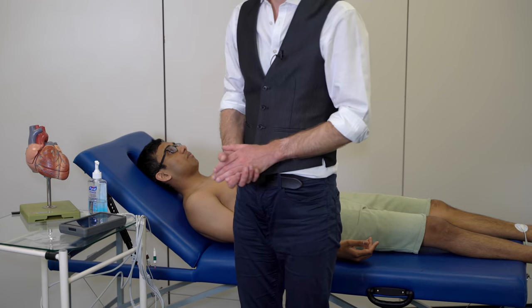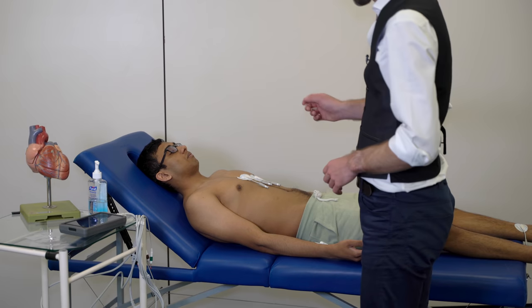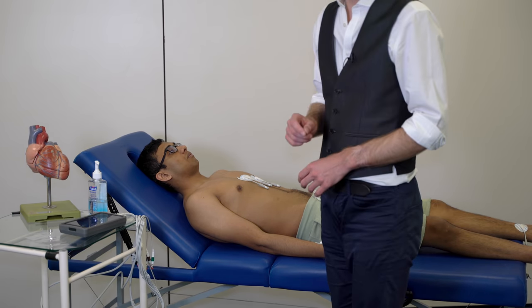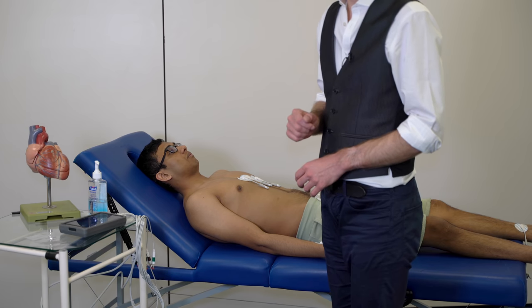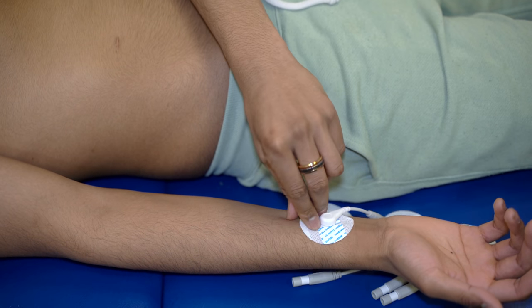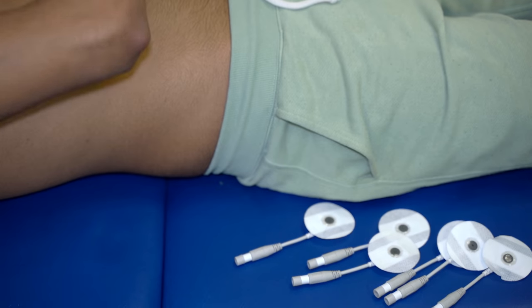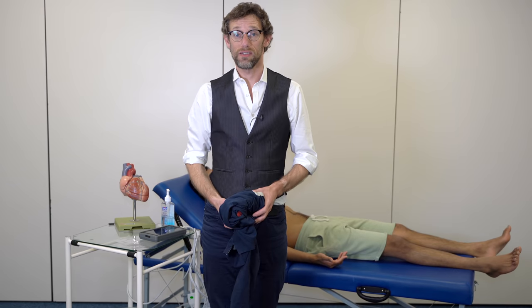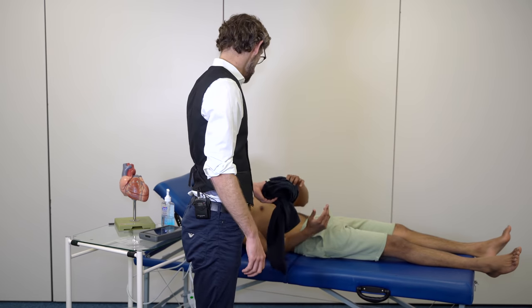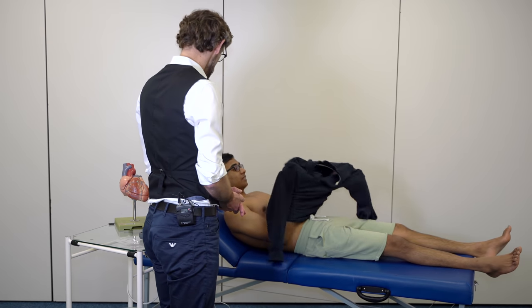Once we've unwired the patient, we allow the patient to remove their electrodes themselves, making sure we're keeping hold of the attachments and disposing of the actual adhesive patches in medical waste. If you'd be kind enough to take off the electrodes. Once we've completed the examination, we thank the patient and make sure we return their shirt to them. Thank you — any questions? No, thank you. Well, thank you very much for your time.